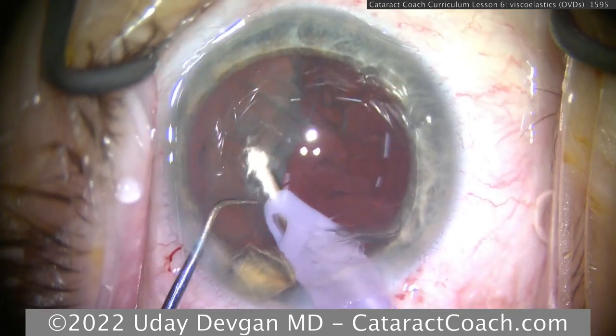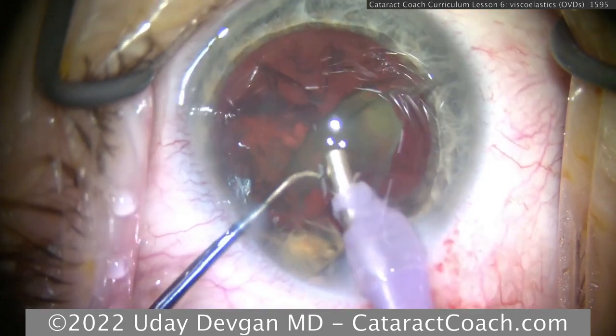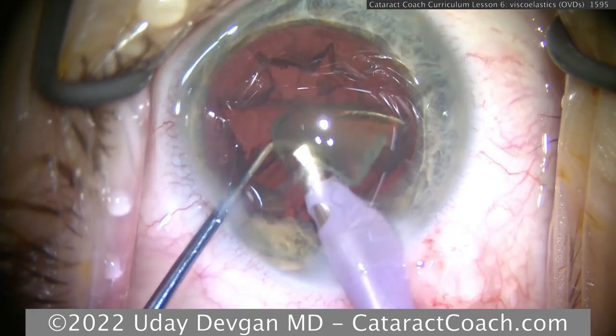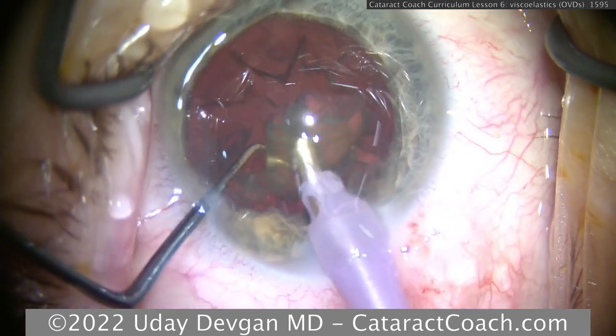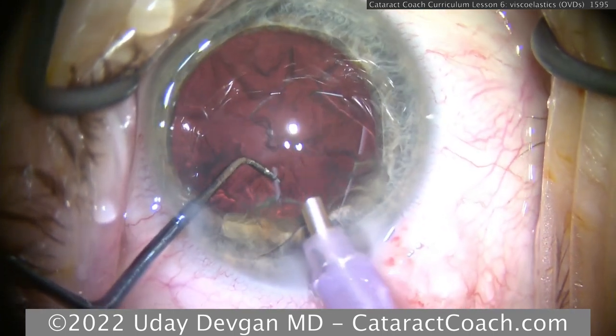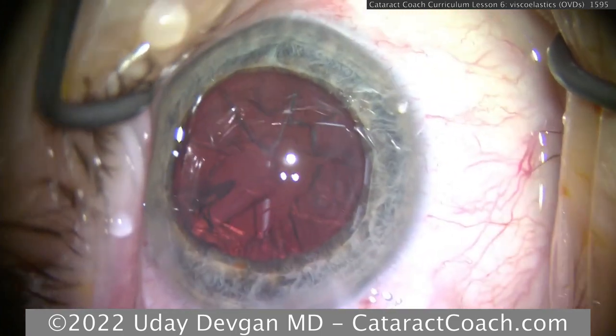And then the second half of the nucleus comes up. We'll do one little chop. There we go. And then the remaining pieces can be aspirated. So with this much viscoelastic protection, as well as a short surgery, we can be sure they're gonna have a clear cornea tomorrow. There's the last little piece of the nucleus coming out, and we're ready for our IA.